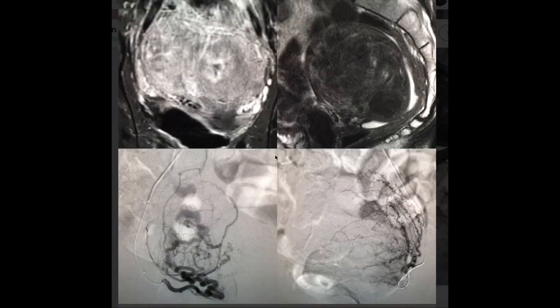This is just another example of a very frequent embolization that we perform. This is for a benign condition called uterine fibroids. In the upper pictures here, this is an MRI. This whole thing here and here is a giant fibroid-filled uterus. You can see how much space it's taking up in the pelvis. It causes a lot of heavy bleeding and bulk-type symptoms like pressing on the bladder and the back, the colon, the spine. And then finally, here are images from the actual arteriogram showing the catheter coming in and into the artery that supplies this fibroid tumor, and it's on the other side, the left side.